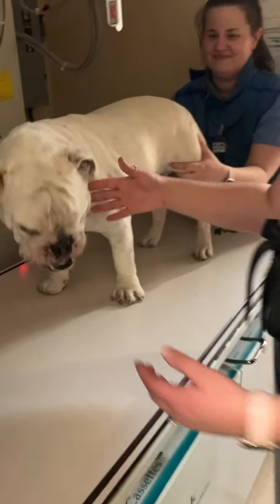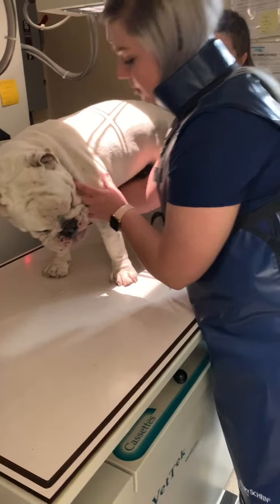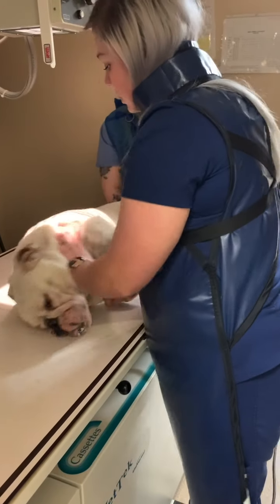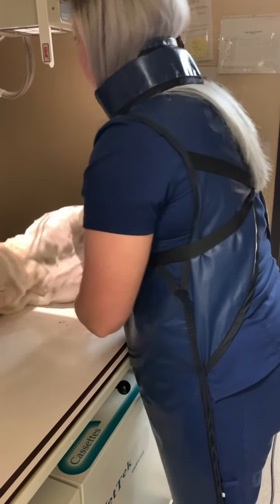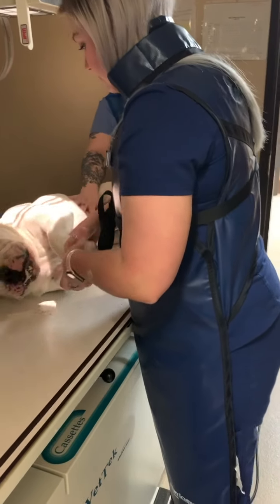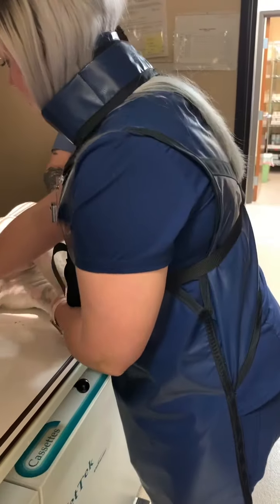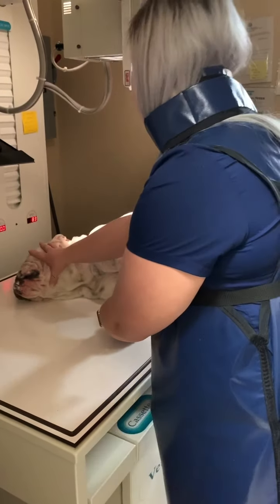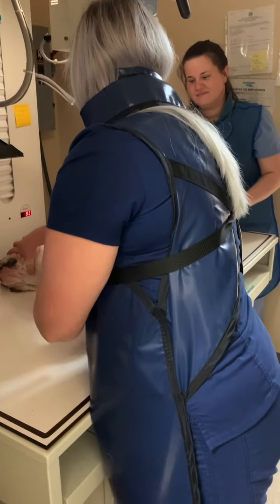And now we're going to take the x-ray. So we'll put him back on this side for the lateral view. Marker in. So we are going to position him and make sure that on there it shows it's ready.